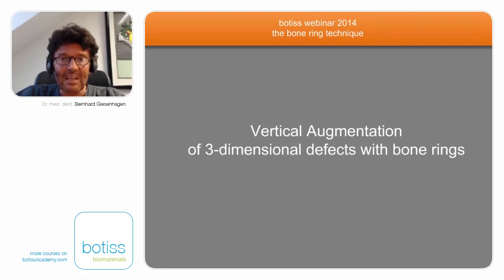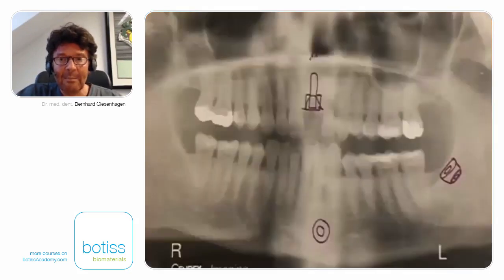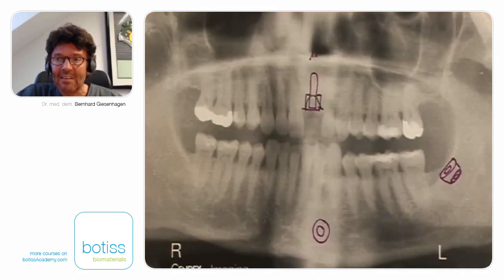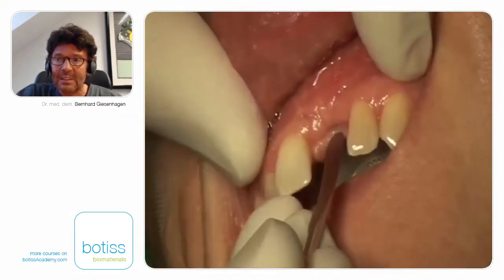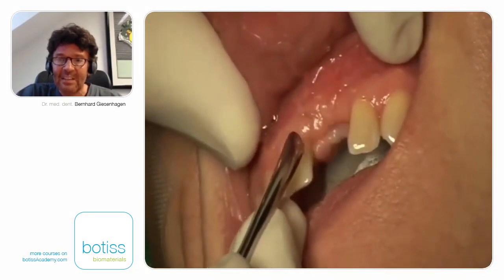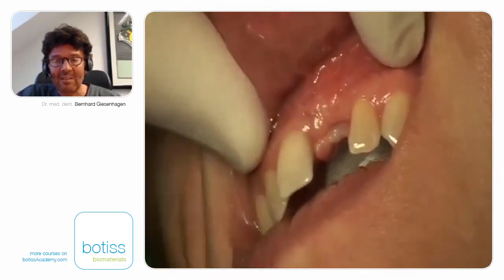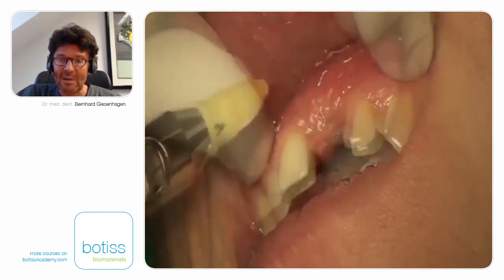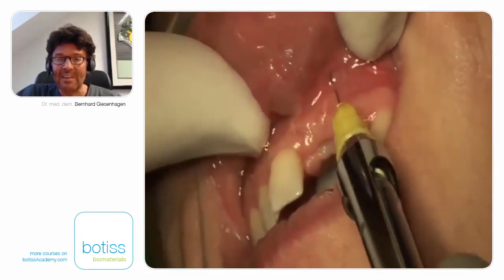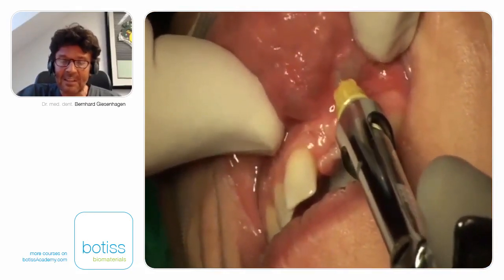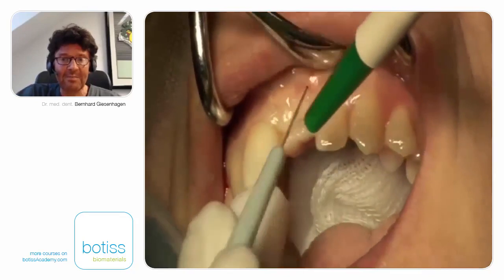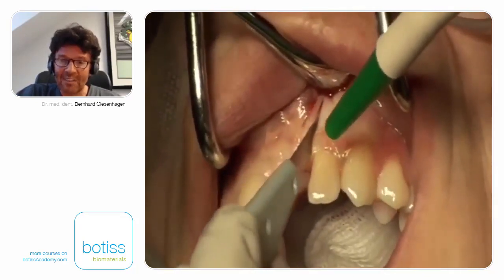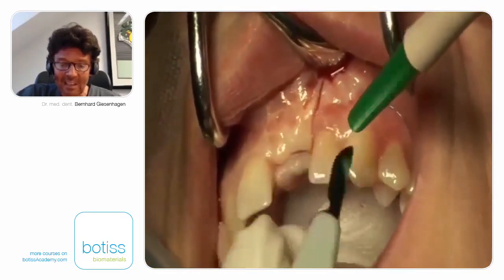First I want to show a clinical video — a typical case. A young patient comes to our clinic with a defect. There is scar tissue because some months or years before, augmentation procedures failed. Now this patient comes to us with scar tissue on the crest, which increases the risk of dehiscence due to malnutrition of the scar tissue. I make a horizontal incision on the crest and two vertical cuts very close to the defect.